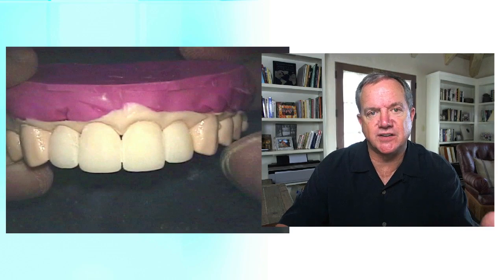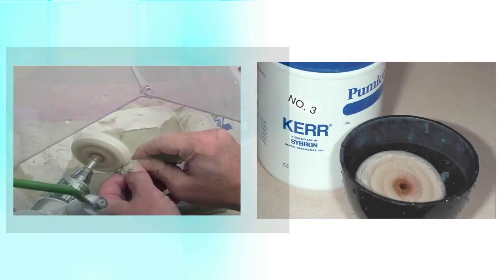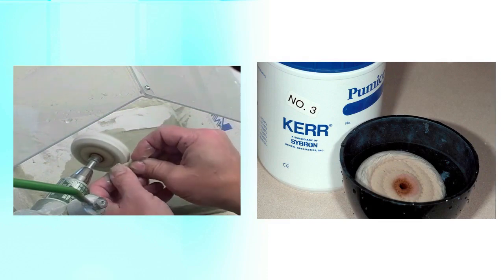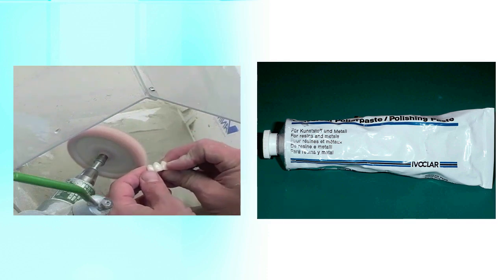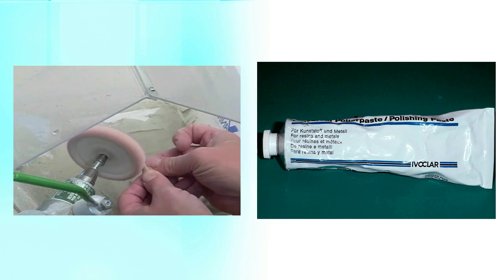And really, getting the temporary to this point pretty much gets it ready to then be polished. We've done all of our other work to this point. And as far as polishing the temporary, I do it using a lathe and number 3 lab pumice on a very wet rag wheel, slow speed, and just keep it moving across there. We then follow that up with Ivoclar polishing paste and a dry rag wheel. Again, typically at slow speed. And that's how we get our final surface finish on the temporary.